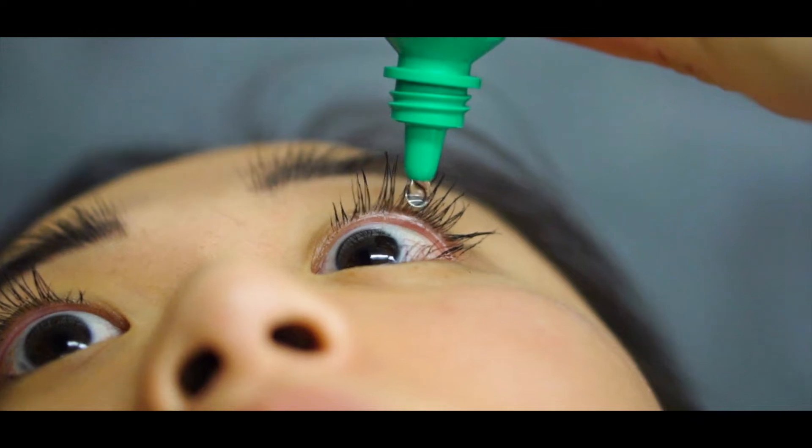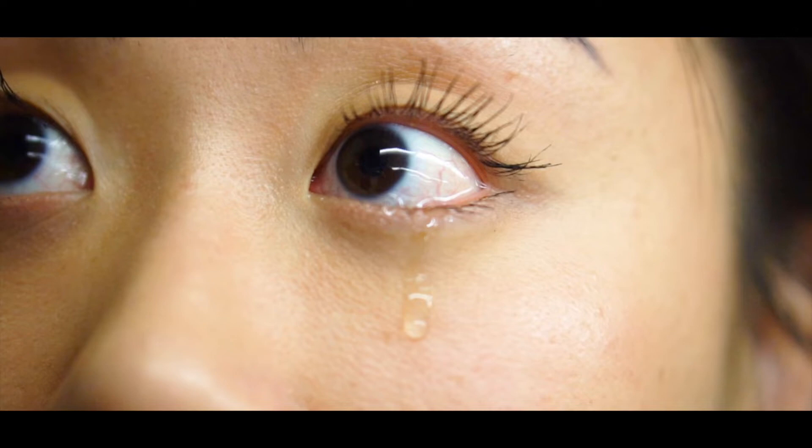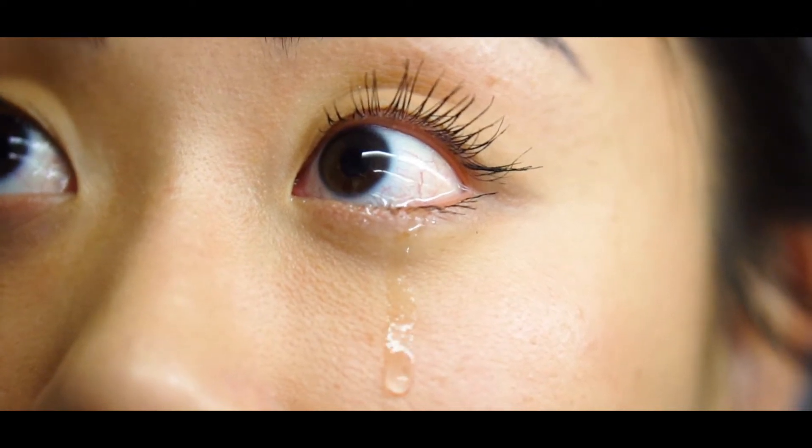Really, we learned that eye drops are five times too big for the eye. For every single drop that goes in the eye, 80% of that is wasted. And so we've all kind of had that experience, right?